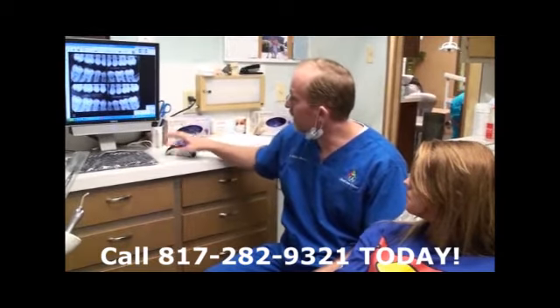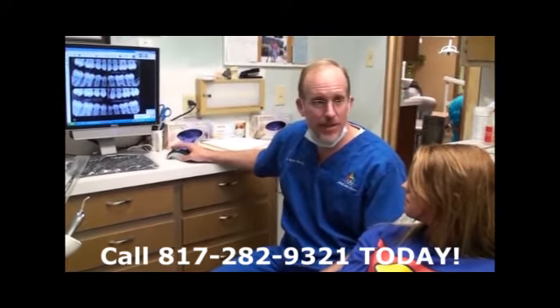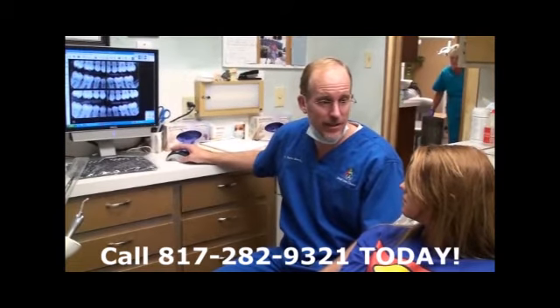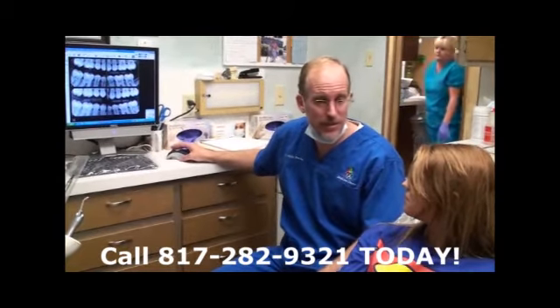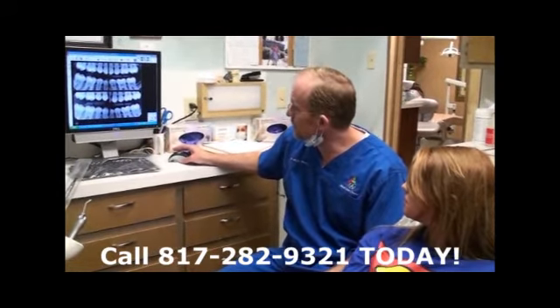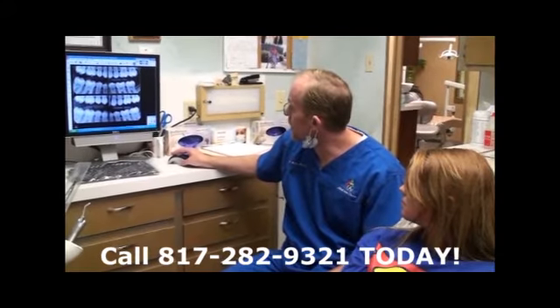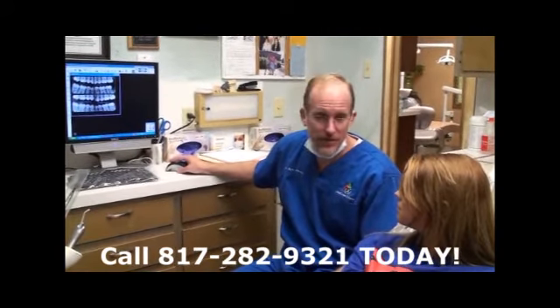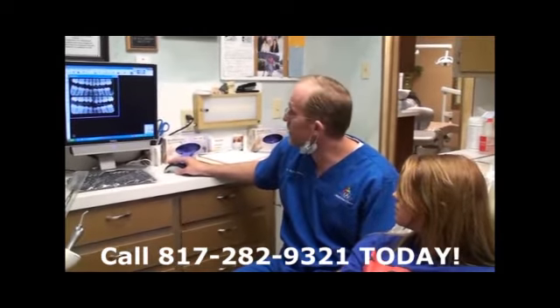And so that's why a lot of people tend to get cavities in between their teeth, but when they smile, they don't see anything. Everything looks healthy, looks nice, but that's because they just can't see the cavity. So this is what x-rays do for us, it shows us where you have cavities. And I'm going to show you an example of a cavity on an x-ray that we see.